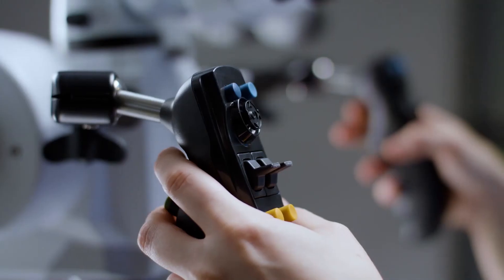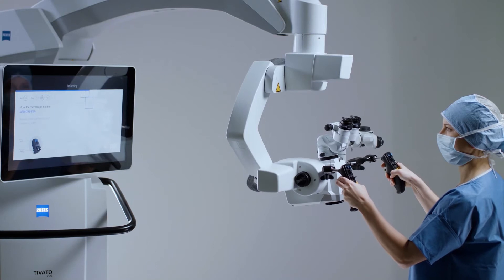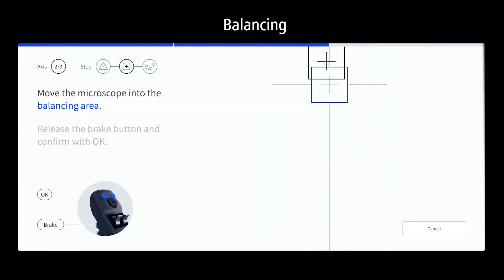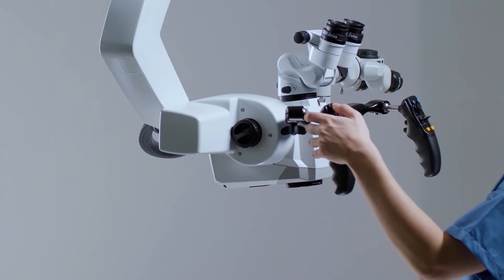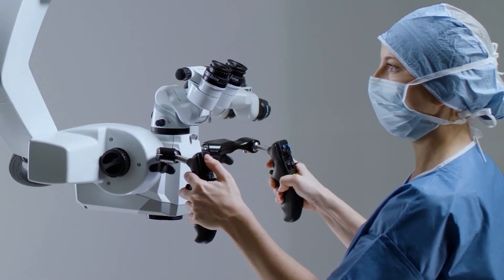Continue with the next axis by pressing the brake button on the back of the handgrip. Move the system into the balancing area where both crosses align and turn green. Confirm with the OK button.